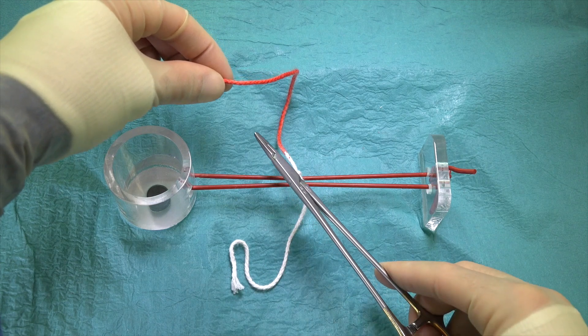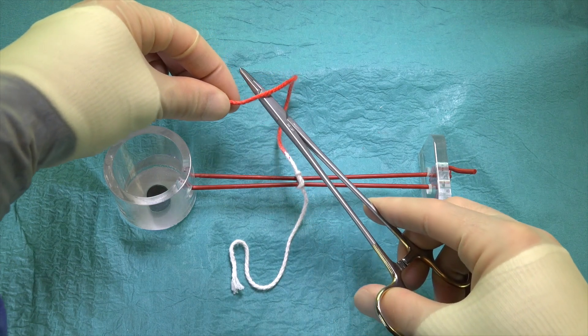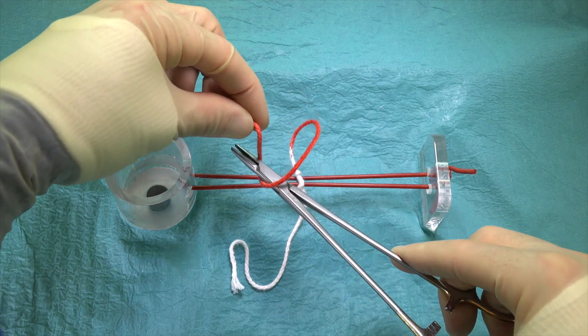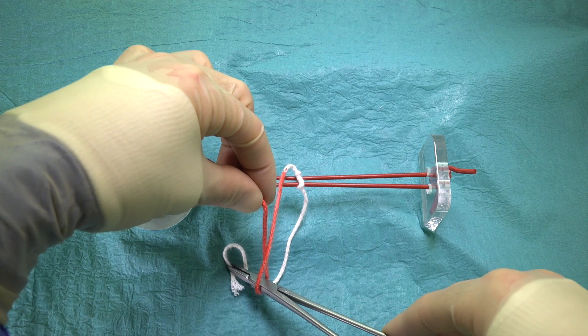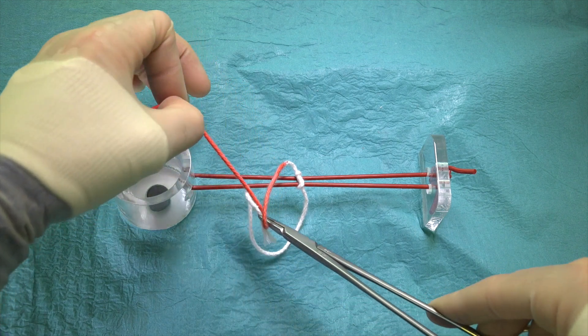We reposition the instrument holder over the suture again, and then the left hand, which is holding the suture end lying away from us, loops the suture over and around the needle holder. But on this occasion, we only form one loop.